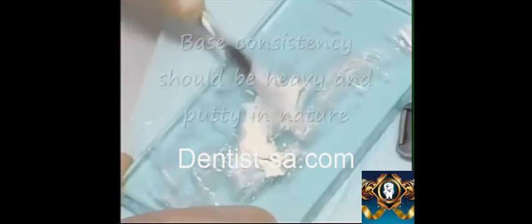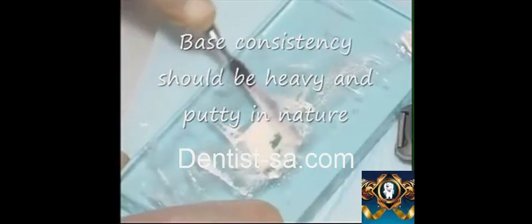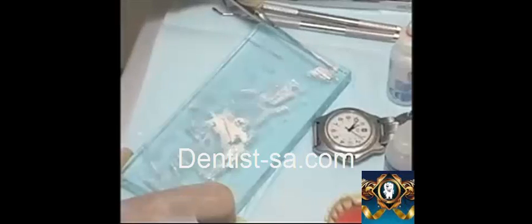The primary consistency mix is used for inlays, onlays, and crown cementation. The secondary consistency is the cement base consistency. The unused powder from the upper right corner is now incorporated, perhaps in increments of one quarter, and thoroughly mixed until a slightly tacky but heavy putty-like mass is developed. The secondary consistency mix should be completed within two to two and a half minutes from the beginning of the mix. This secondary consistency demonstrates a carving advantage, an ease of placement, and a decreased setting time.